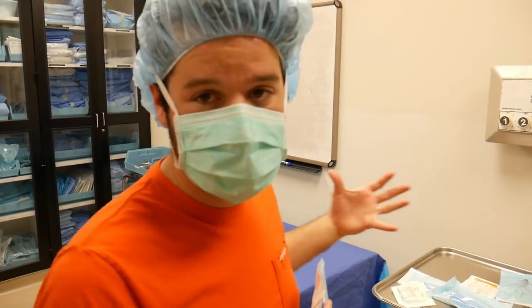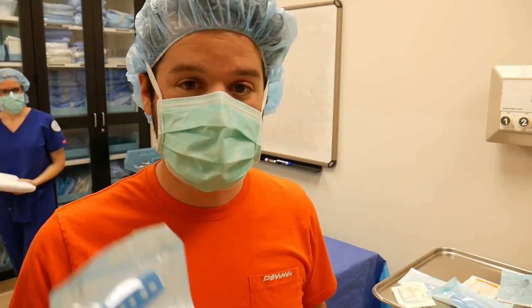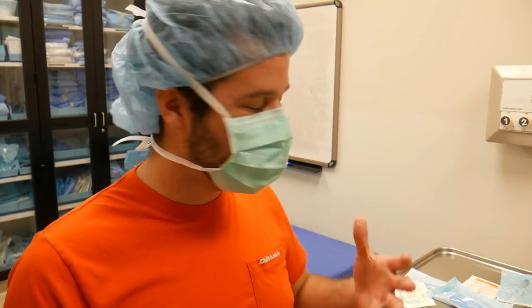Hey guys, welcome back to another Surgical Tech Tips. We're here still at CSN making some videos and this is going to be going over opening up items onto a sterile field — proper technique on opening up sterile items onto a field.